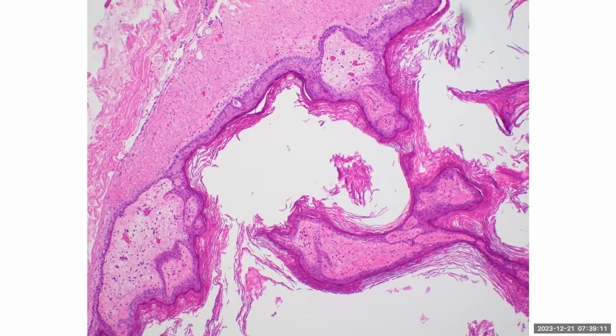And then the variants of all that architecture, with winding and making nooks and corners here and there, depend on the cut of the histological section. So it is an epidermoid cyst. Next.